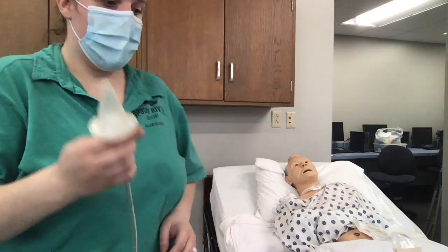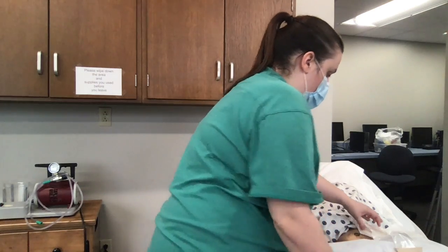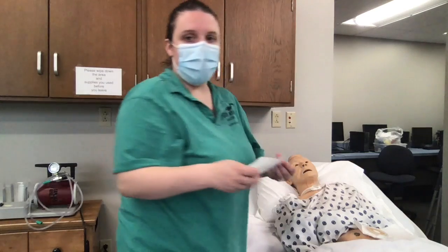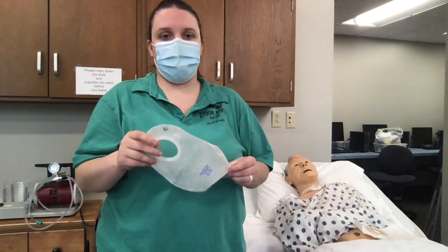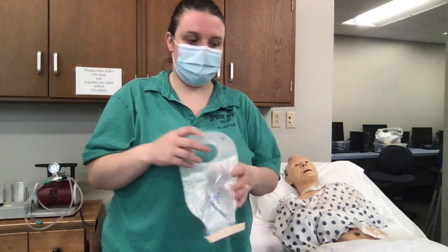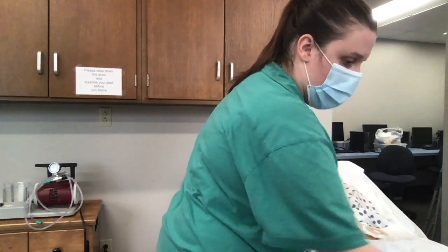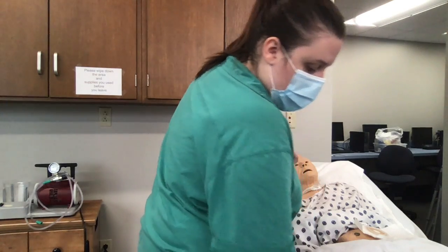and before I irrigate, I'm going to take the patient's colostomy bag off and empty it into a bedpan or into the toilet, whatever my agency policy is for that, or measure it if necessary. So I've got my bedpan over here. I just empty it in my bedpan. Excuse me.